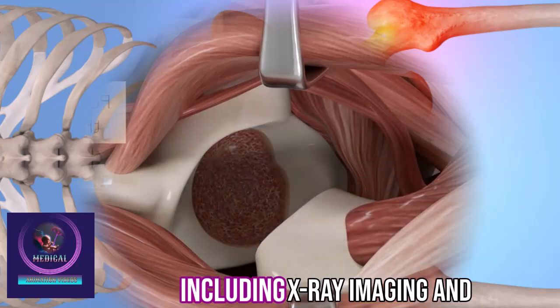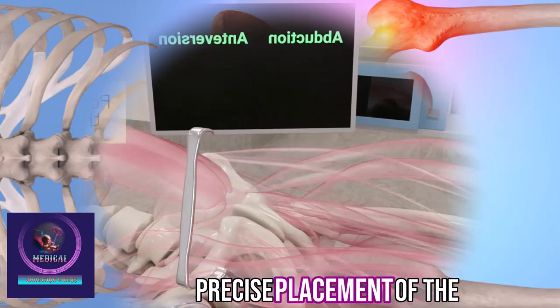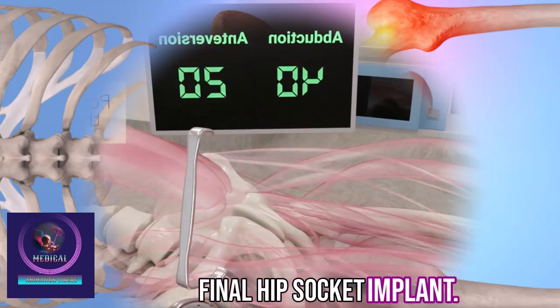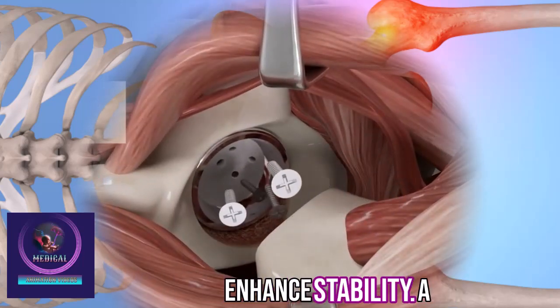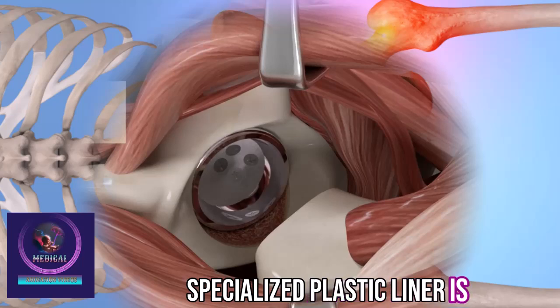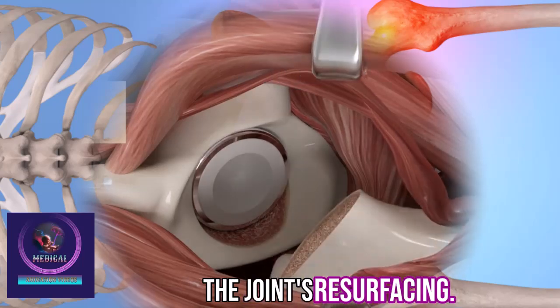Advanced tools, including x-ray imaging and digital navigation, ensure precise placement of the final hip socket implant. Small screws may be added to enhance stability. A specialized plastic liner is then locked into the titanium socket implant to complete the joint's resurfacing.